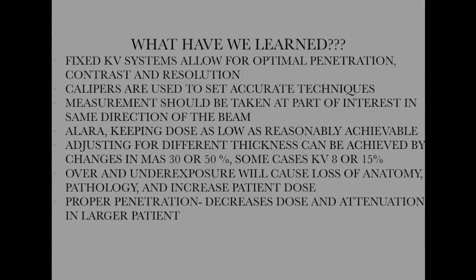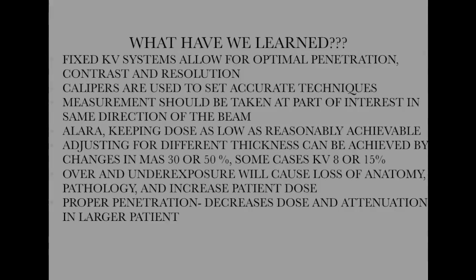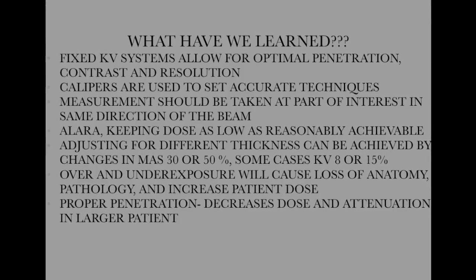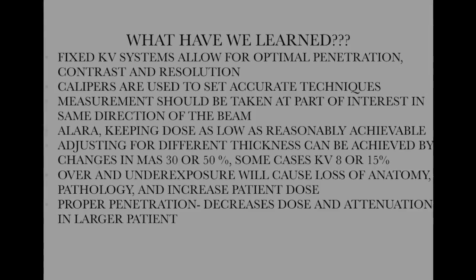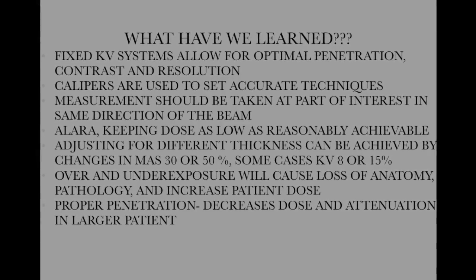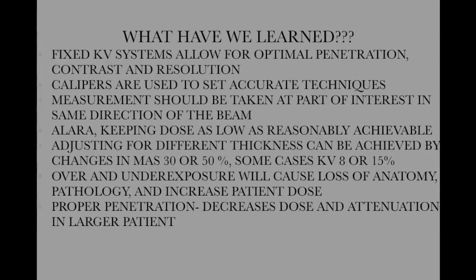We also always adhere to the ALARA principles, keeping the dose as low as possible for the patient and the technologist. We do this by using a fixed kV system, which is good for an average person, but the adjustments for a smaller and larger patient vary by the degree of size differences. First, we would try to adjust our mAs by either 30% or 50%, and in extreme cases, we may have to adjust the kV by 8% or 15%.